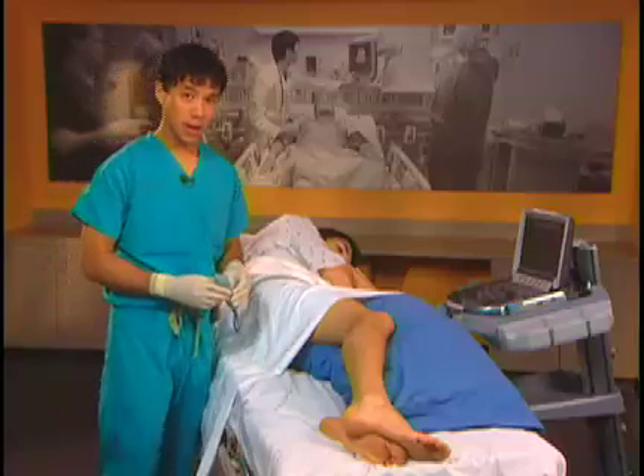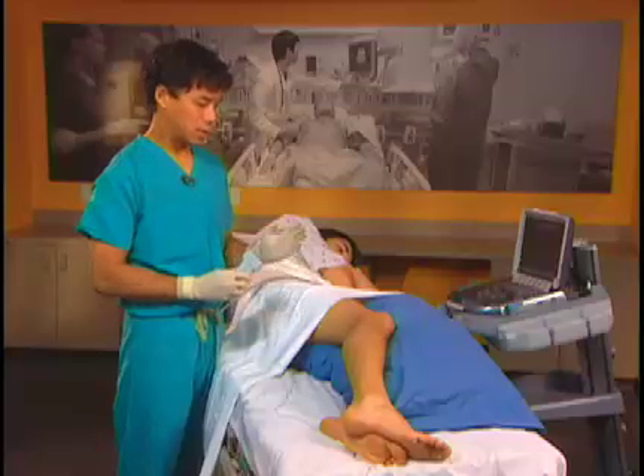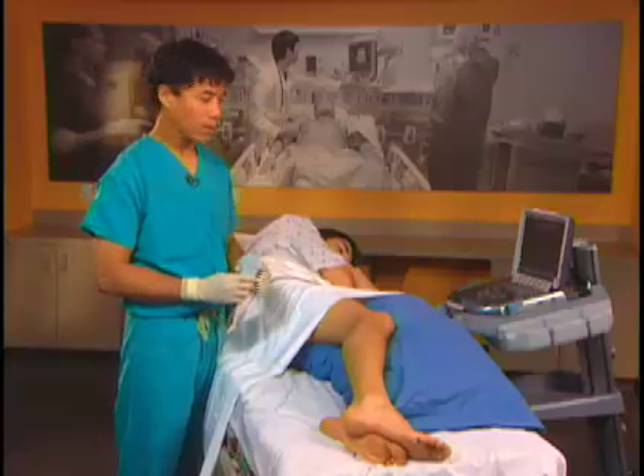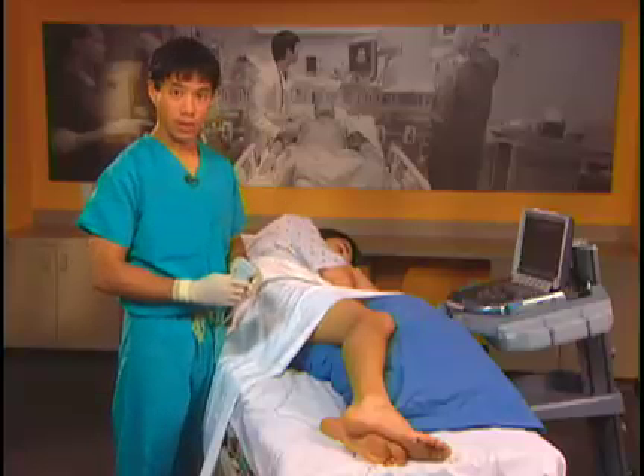To do the popliteal sciatic nerve block we use a linear probe. The linear probe allows us to see structures well in the shallow plane and gives us a wide field of view to see our needle approaching the nerve.